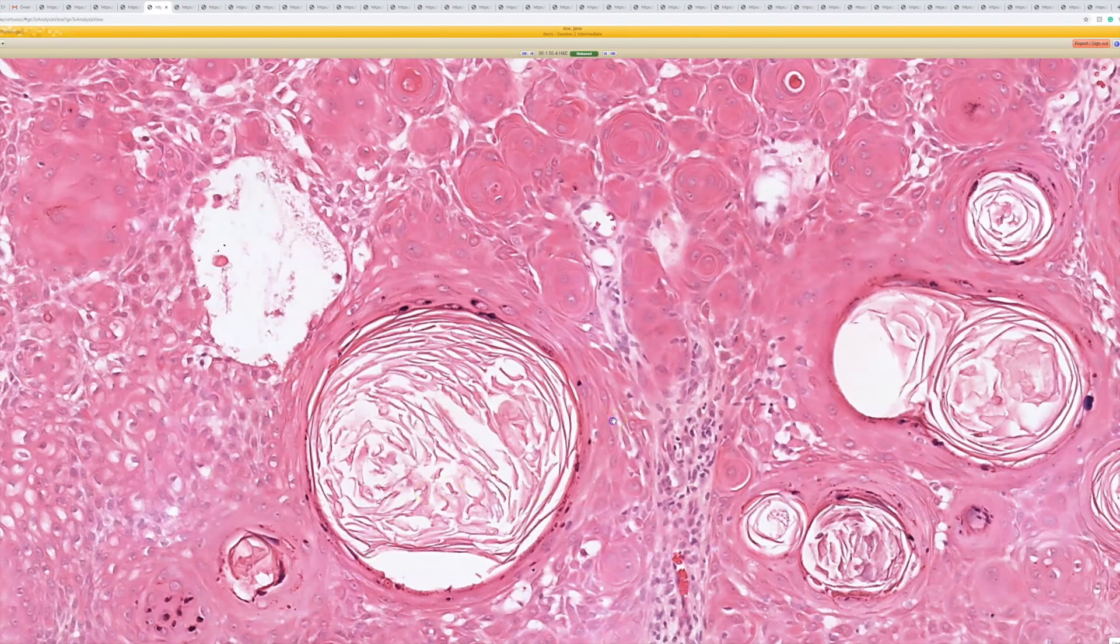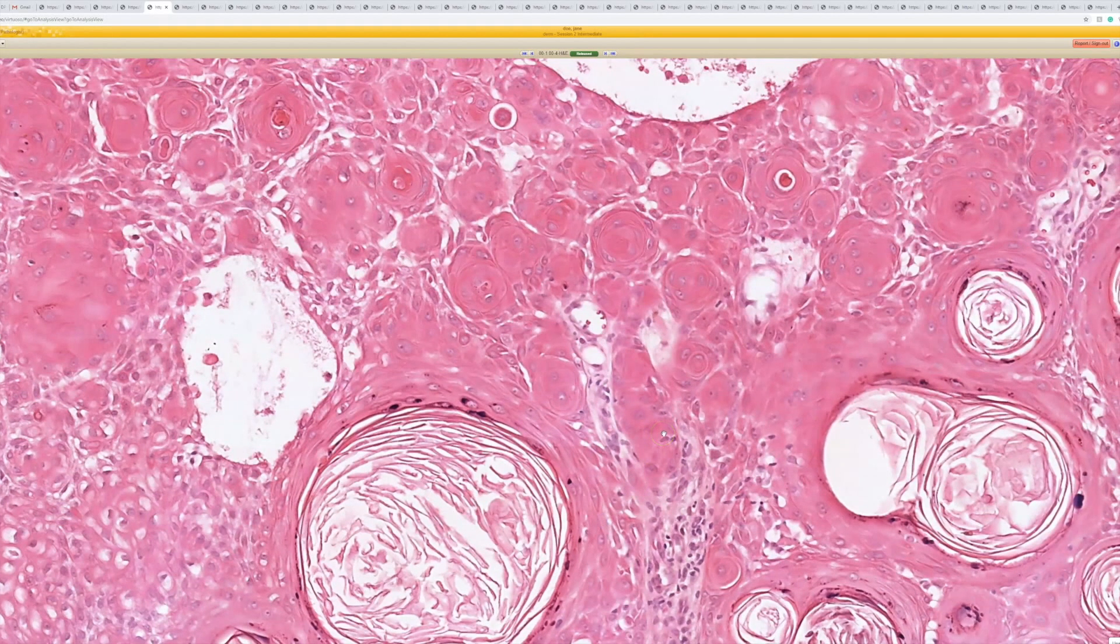Squamous eddies are also in the epidermis or within an epidermal-based lesion, and they're made of actual viable living keratinocytes that are swirled and whirled together into a little glassy nodule.